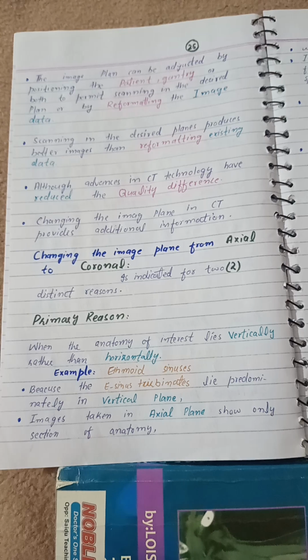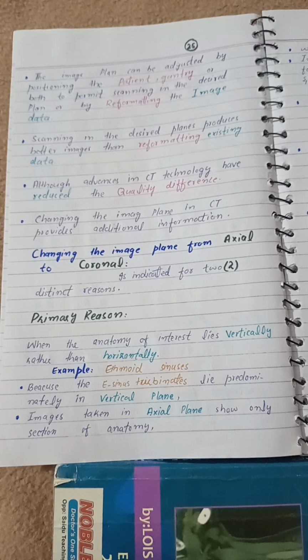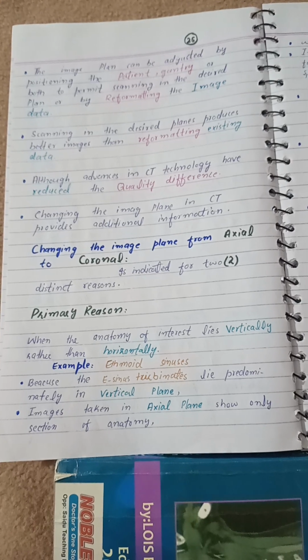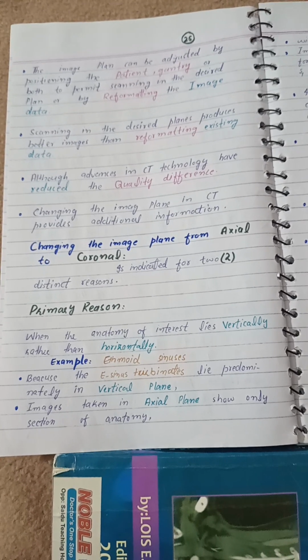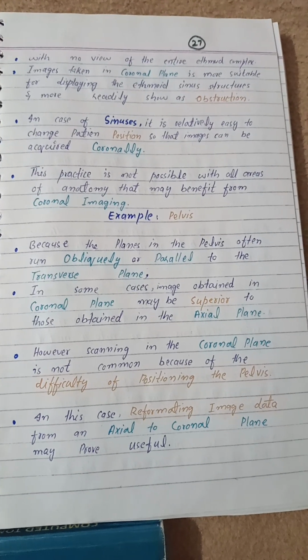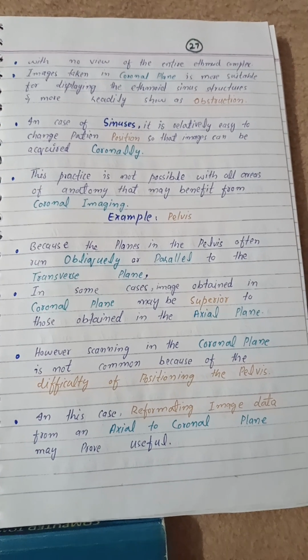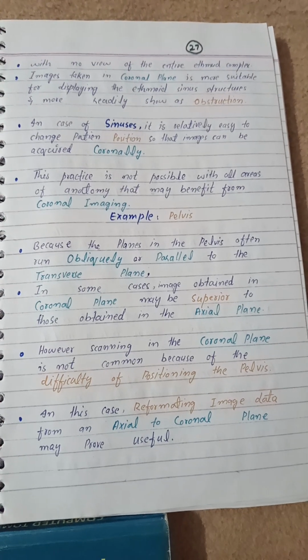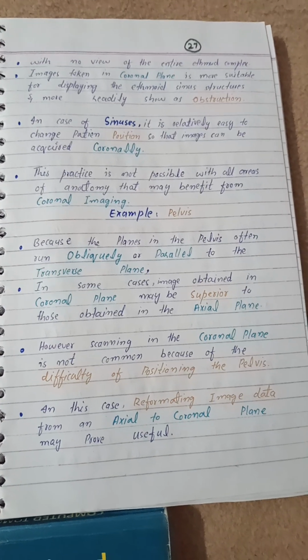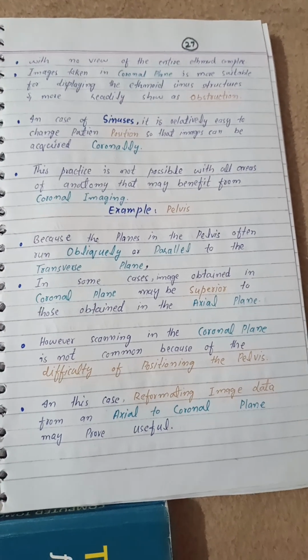Example: the ethmoid sinuses. Because the ethmoid sinuses and turbinates lie predominantly in the vertical plane, images taken in the axial plane show only a section of anatomy, with no view of the entire ethmoid complex. Images taken in the coronal plane are more suitable for displaying the ethmoid sinus structures and more readily show an obstruction. In the case of the sinuses, it is relatively easy to change patient position so that images can be acquired coronally.